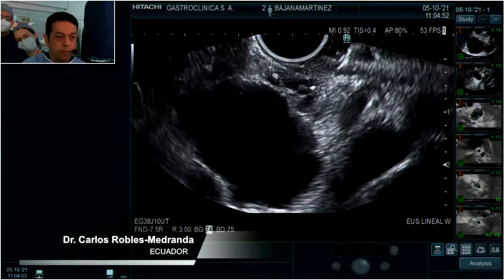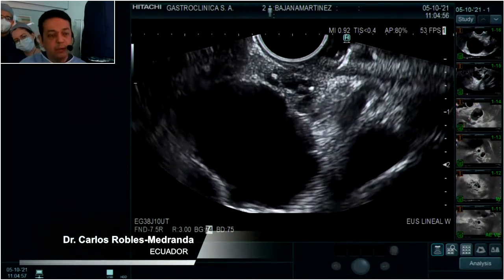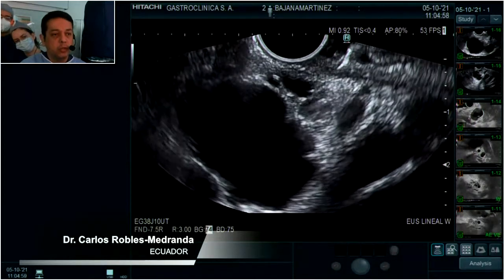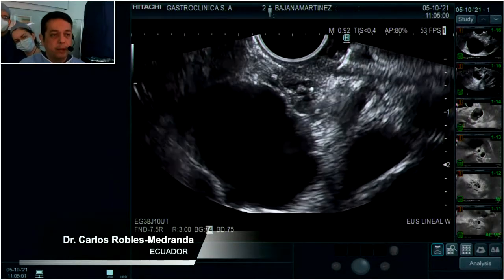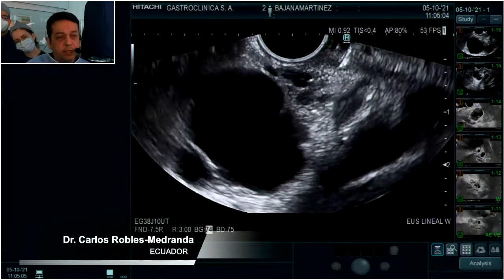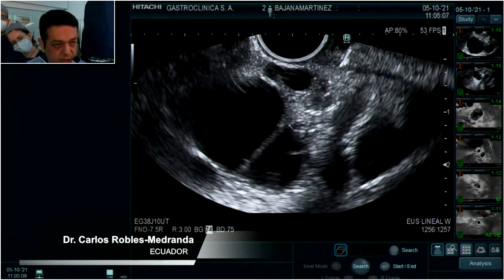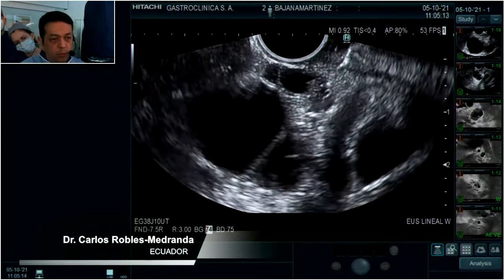So when we are in front of this lesion, we need to do an evaluation with B mode using US. As we are looking here, we have a macrocystic lesion, but when I turn a little bit, I see that this cystic lesion has a septum here first. So what do you see more?